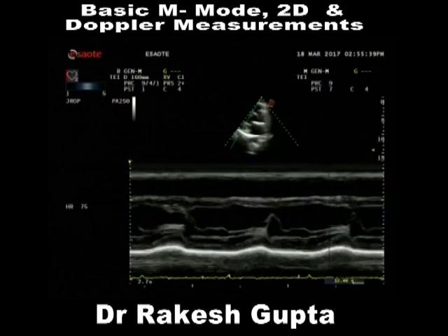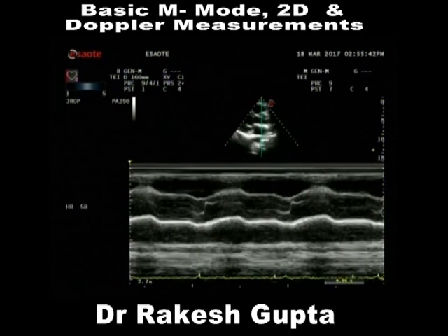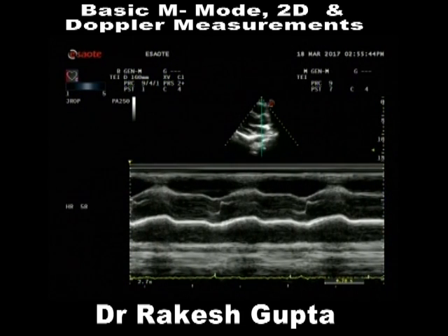Did you see what I did? I did not do anything except for the fact I started scanning in the plax window, where the aorta was almost horizontal. Clear? I have dropped a line right into the center, and if this sector is 60 degrees, the line is at 30 degrees. 30 degrees this side, 30 degrees this side.